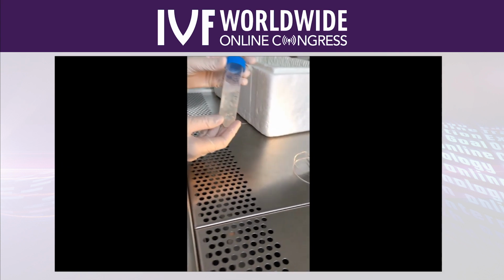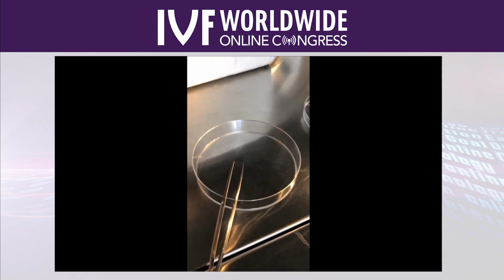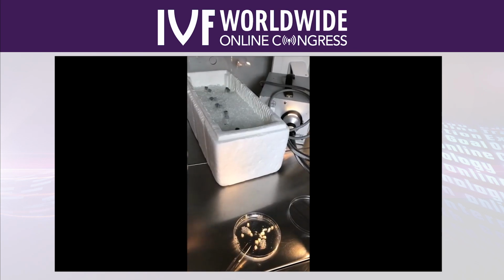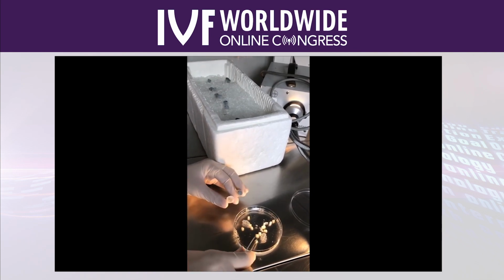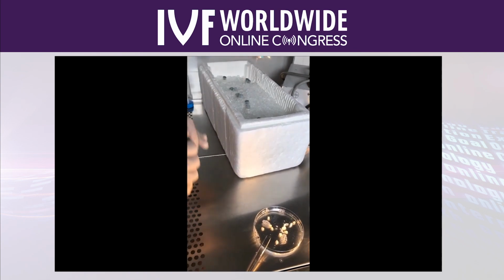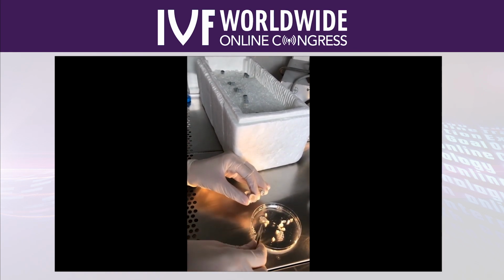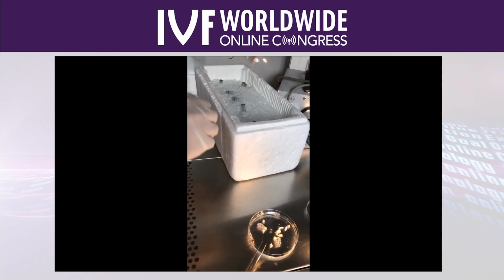So here, after the 30 minutes, we take out the pieces and transfer them to these small cryotubes with the same freezing media. Normally we have 1 to 2 pieces of tissue per cryo vial. But in this case with the little girl here, you can see we just put 1 piece because she doesn't have that many pieces.